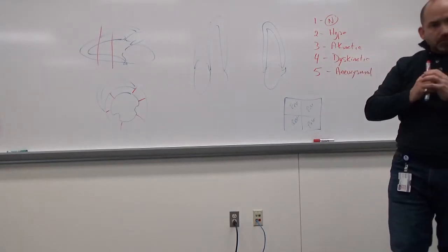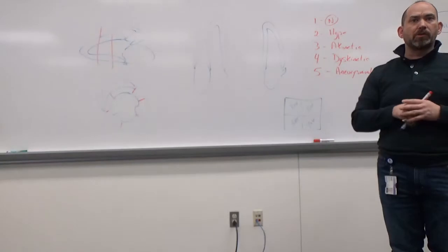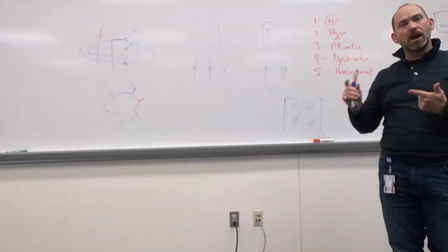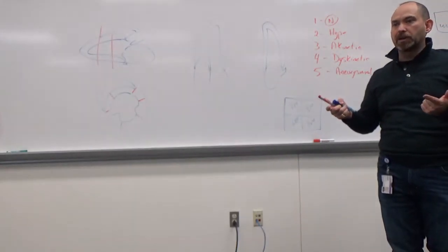In the heart, we're looking for blood supply to go through the muscle, and if I've got a stenosis, what would you expect to see with the contrast? If we're not getting blood supply to a certain segment, it's not going to fill in, right?